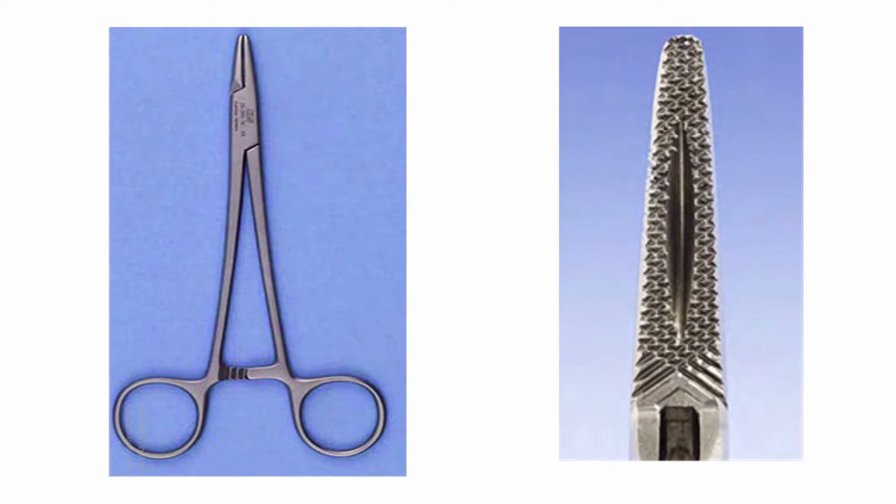So this is an example of a needle holder. You can see a locking handle, and if you look at the face of the beak, it has a cross-hatch appearance.